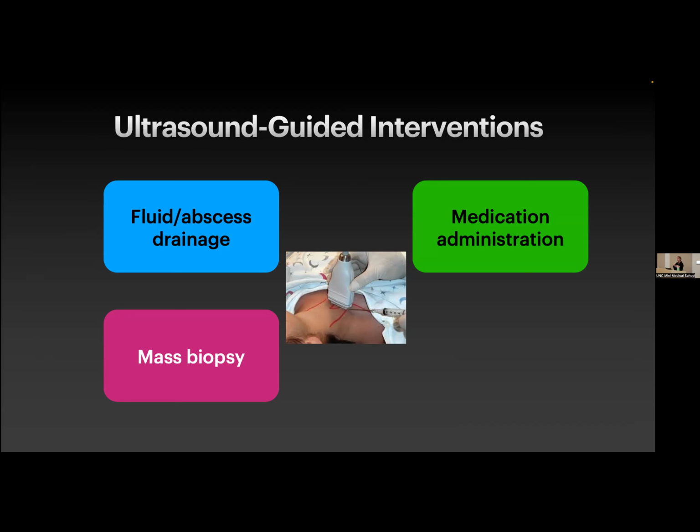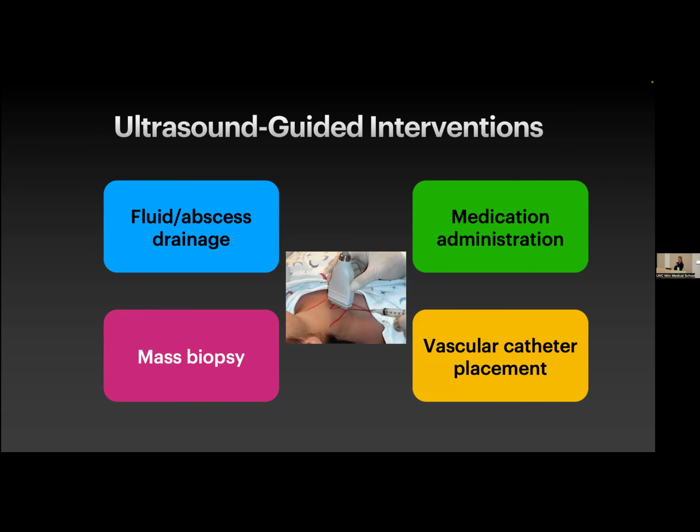Typically, we think of cancer treatment as systemic and all throughout the body, but there are some emerging uses where we can target specific areas and provide treatment directly to that area and not have to provide it to the rest of the body. And then if you need a catheter, dialysis patients, patients that are really sick and they need to have monitoring, we can use ultrasound to make sure that we have the catheter put in as safely as possible and in the right location, into the right vessel. So these are just a few examples of how we can use ultrasound to help guide us.